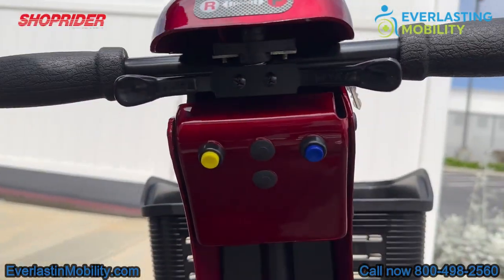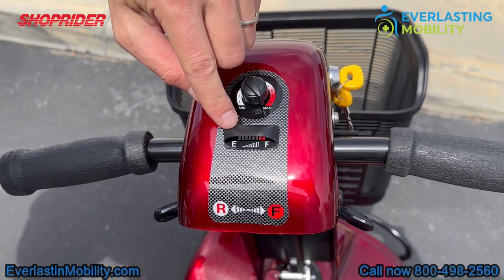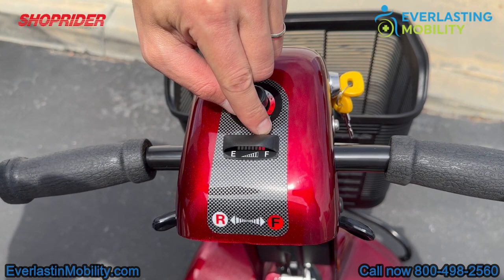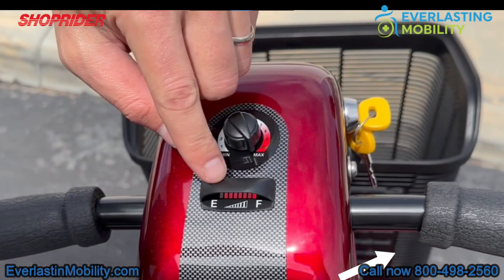Over to the tiller — this scooter comes with two keys to turn the unit on and off. This is the battery gauge, which works just like a vehicle: all bars will be lit when fully charged, and as it depletes, you'll know when it's time to recharge. If you get in the habit of charging the batteries every night for the first couple of weeks regardless of usage, that will help increase the longevity of the battery.